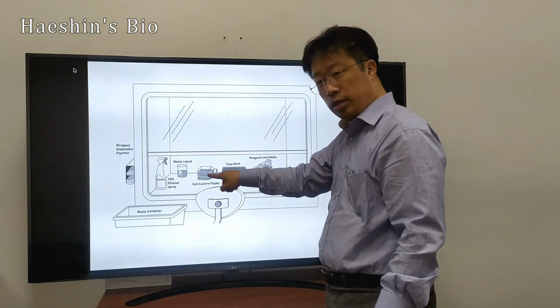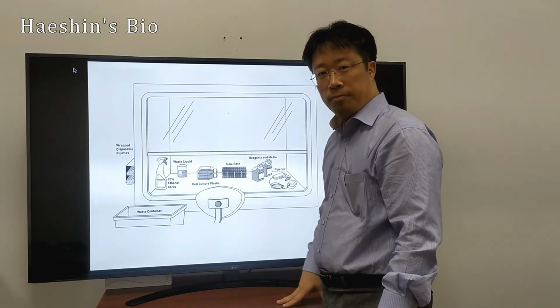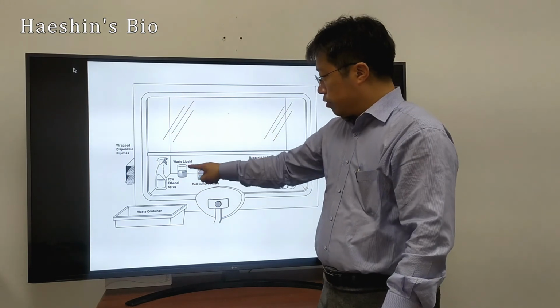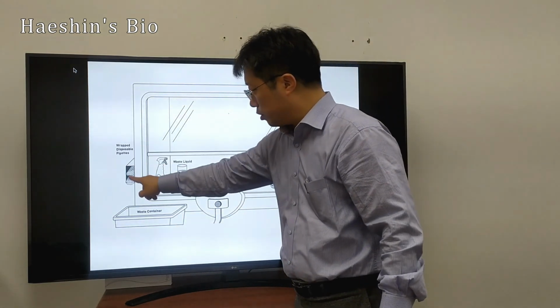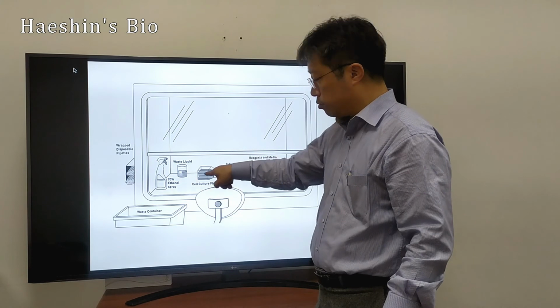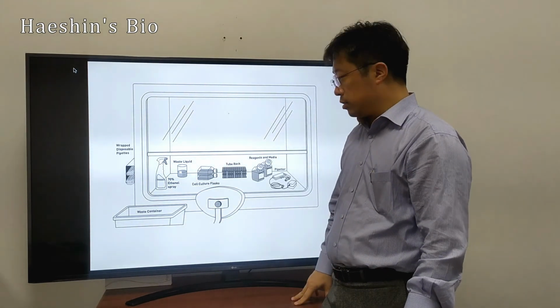You take all the media out of this dish, and then you put new media in there. And this is waste. You have to throw that away here. Then you have certain other pipettes, not seen, but there's a pipette in here. It's simple.